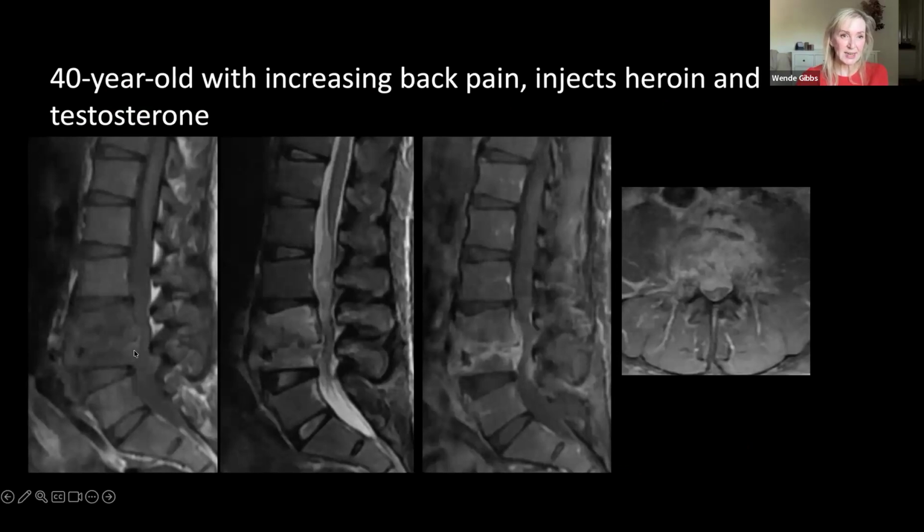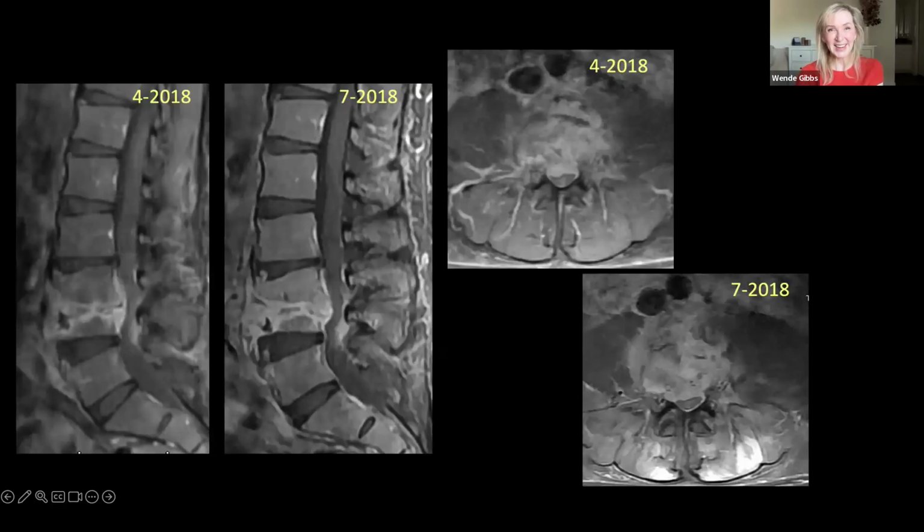So sagittal T1, and like you said, Mike, he's lost those end plates, these black lines, which are so clear everywhere else. He's completely lost that. There's collapse. There's T1 hypointensity because the marrow fat's been replaced by those watery cells. On the STIR, there's fluid signal within the bodies. Again, there's that collapse and starting to be deformity there. On the post contrast, there's epidural, maybe phlegmon, or maybe reactive dura, but probably a little phlegmon there. On the end plates, they're enhancing, and there is some epidural enhancement or prevertebral enhancement as well, on that axial.